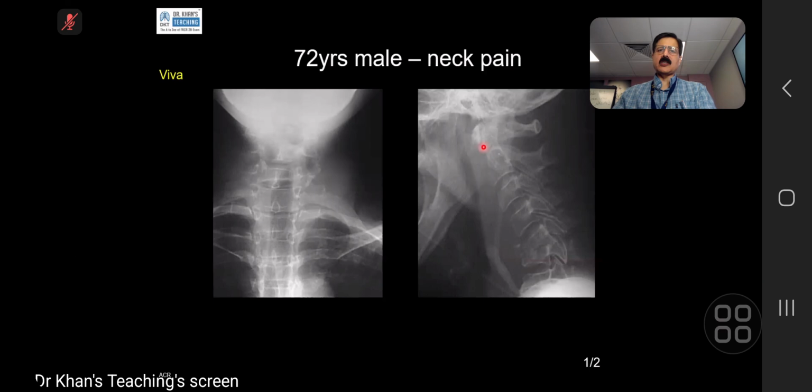This soft tissue anterior to the spine has various measurements. Distal to C5, it is about 2 centimeters. But another formula to remember is that distal to C5, if it is more than the AP dimension of the vertebral body, there is a definite soft tissue abscess.